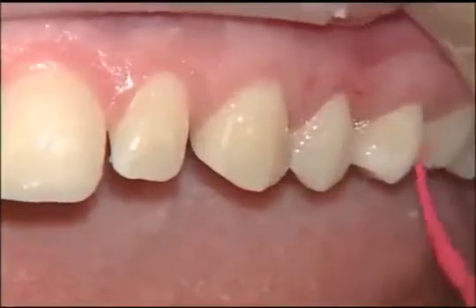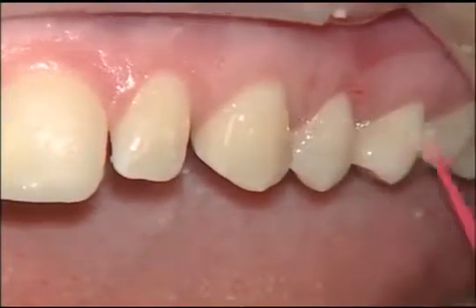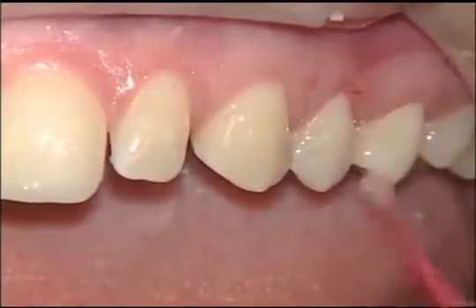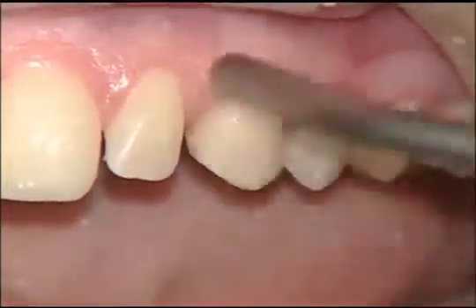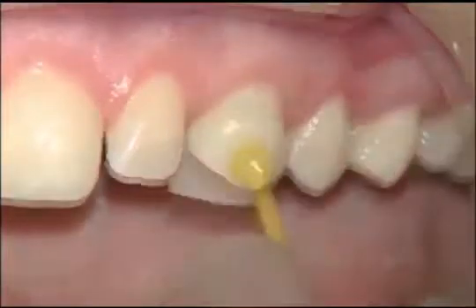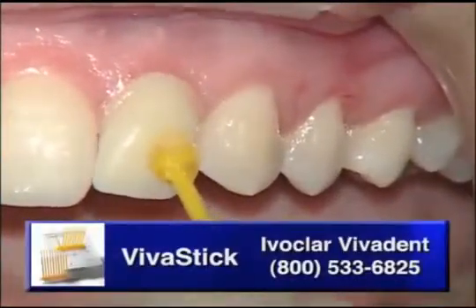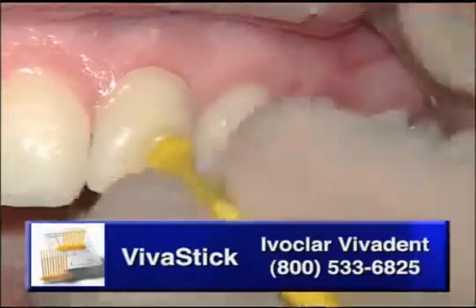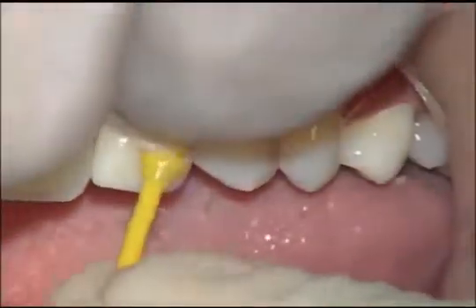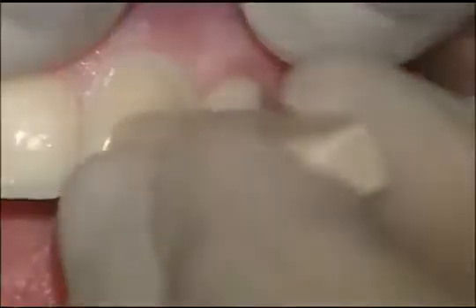Once again, we're applying the adhesive from the Scotch-Bond Multi-Purpose Plus system to the etched enamel surface. As you dry that etched enamel surface, you will notice the frosty appearance that we're used to seeing. And we're going to air thin the adhesive as well. Here we're using a Viva stick from Ivoclar Vivadent to place some of the smaller veneers, and it sticks extremely well to small restorations like veneers or inlays and things like that. In fact, you have to hold the restoration down just to get the stick off.